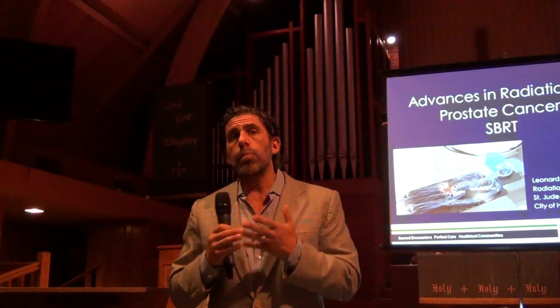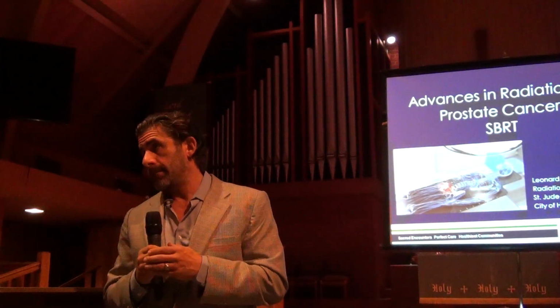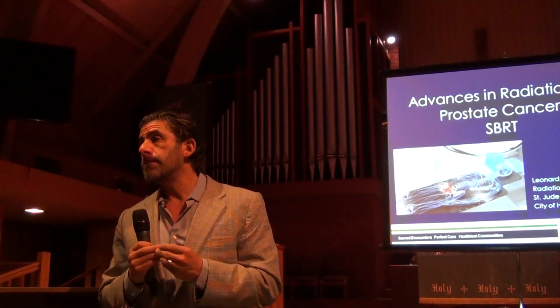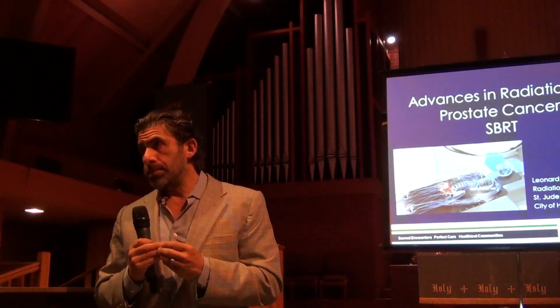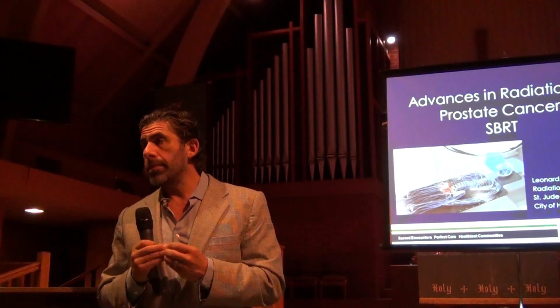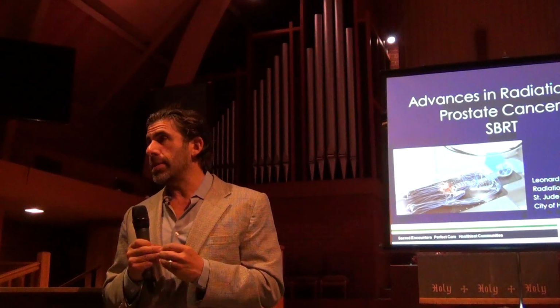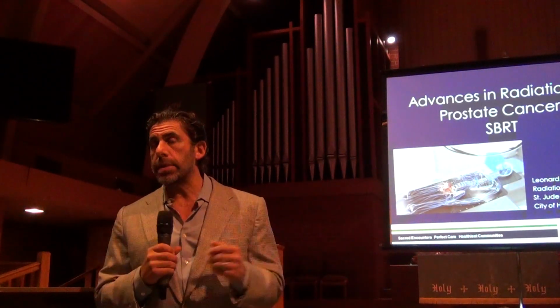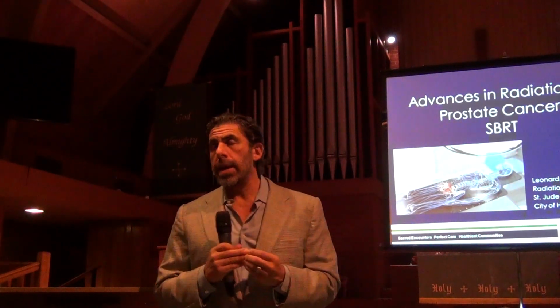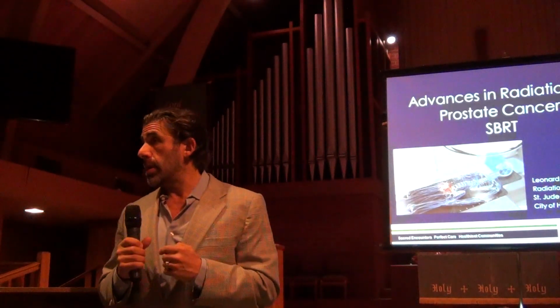More and more studies are going to be done. I noticed reading a study by Katz. Yeah, I think he does about 35 gray. I know Dr. King does 40 gray. So Alan Katz was actually my colleague back in New York, who, when I launched my first SBRT program, had presented his data. Those were data looking at CyberKnife technologies.